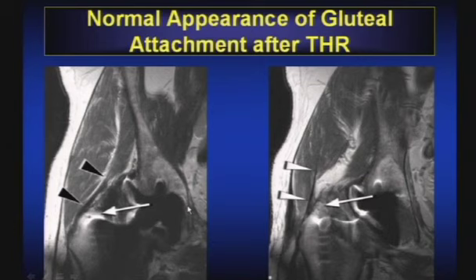And it is very important in the setting of total hip replacement to be able to evaluate the rotator cuff muscles of the hip. Hip prosthetic components can be completely normal from the standpoint of their placement and their appearance on x-ray, but patients can present with chronic pain. That is what's classified as clinical failure of a total hip replacement. So they've replaced the articular surfaces. If the patient still has pain and limited function, it's going to be a failure from the clinical standpoint.